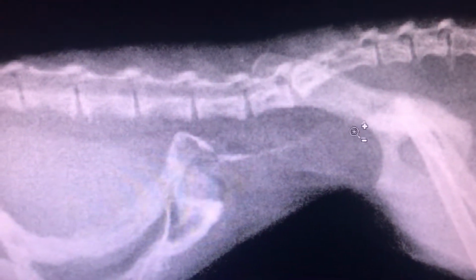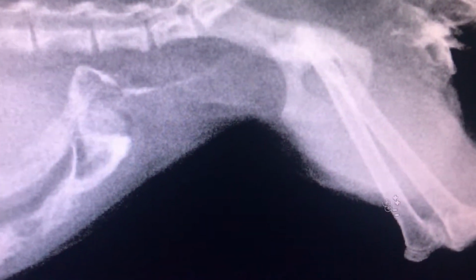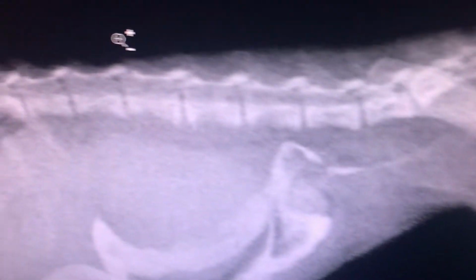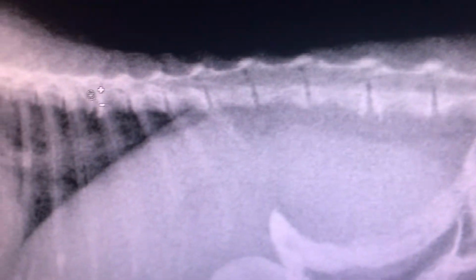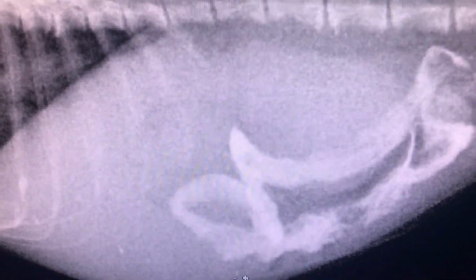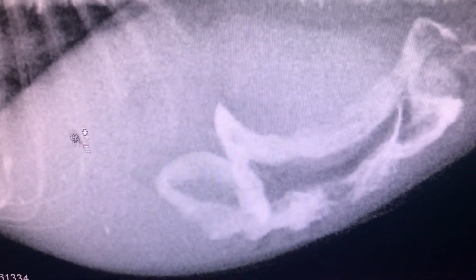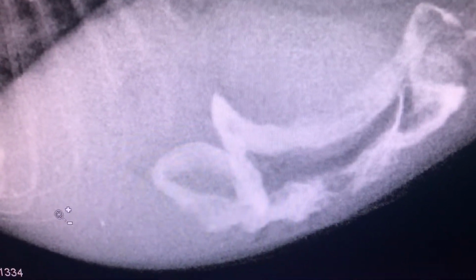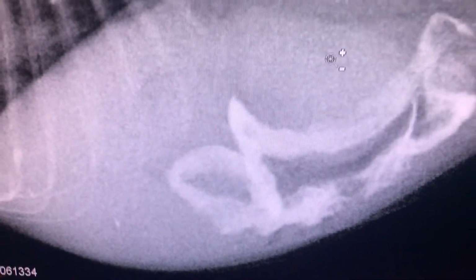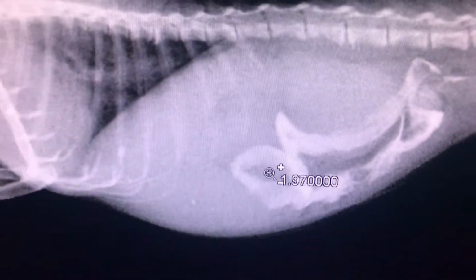The good news is I was worried about metabolic bone disease. All the bone densities seem fine. Nice cortices there, no problems. On the next view, anyway, we'll get there in a second. But obviously there's something here. This is most likely stomach in this area here. Most of this is liver. We don't know what this is right here, and that is something that's large too. So we'll address that with some ultrasound in the very near future.